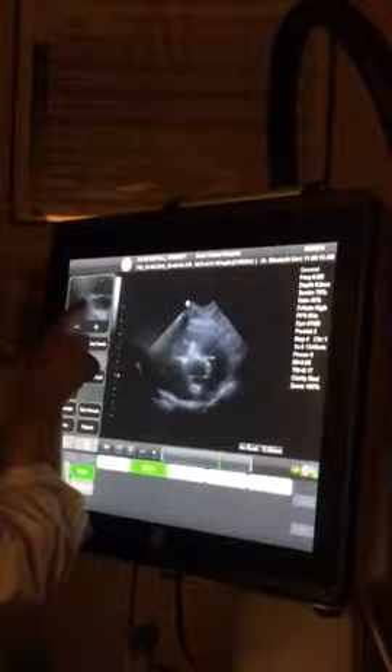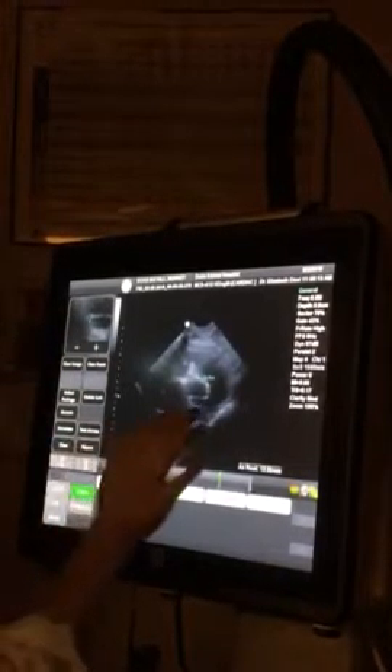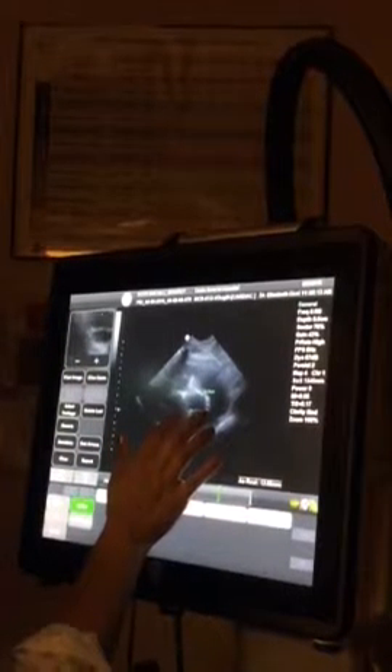It's not on top, right? It's like — if anything, right to the front of it a little. So your goal is kind of lumen to lumen, like Dr. Davis had said.